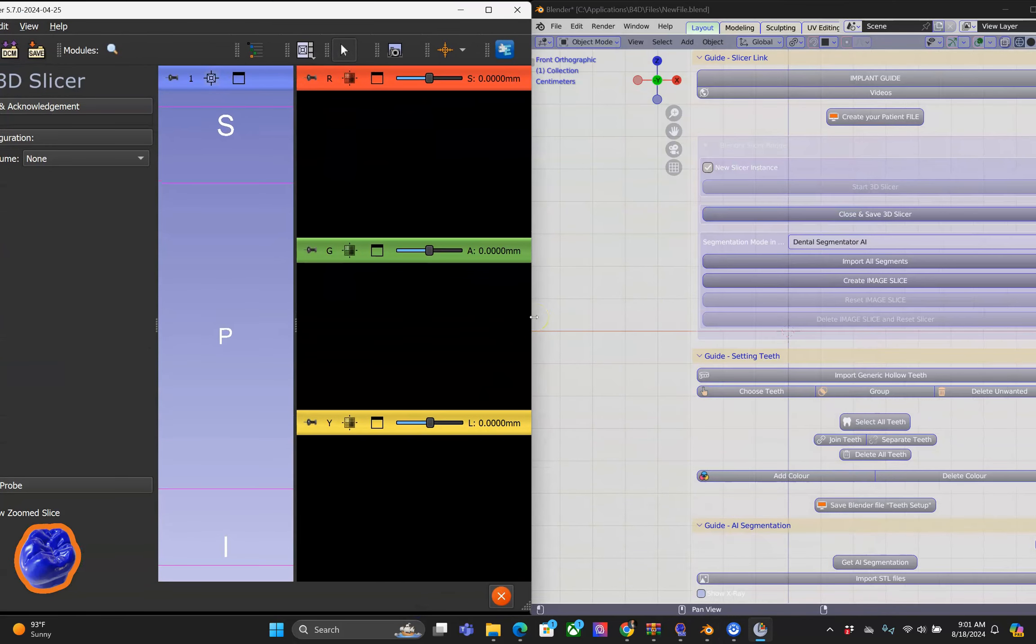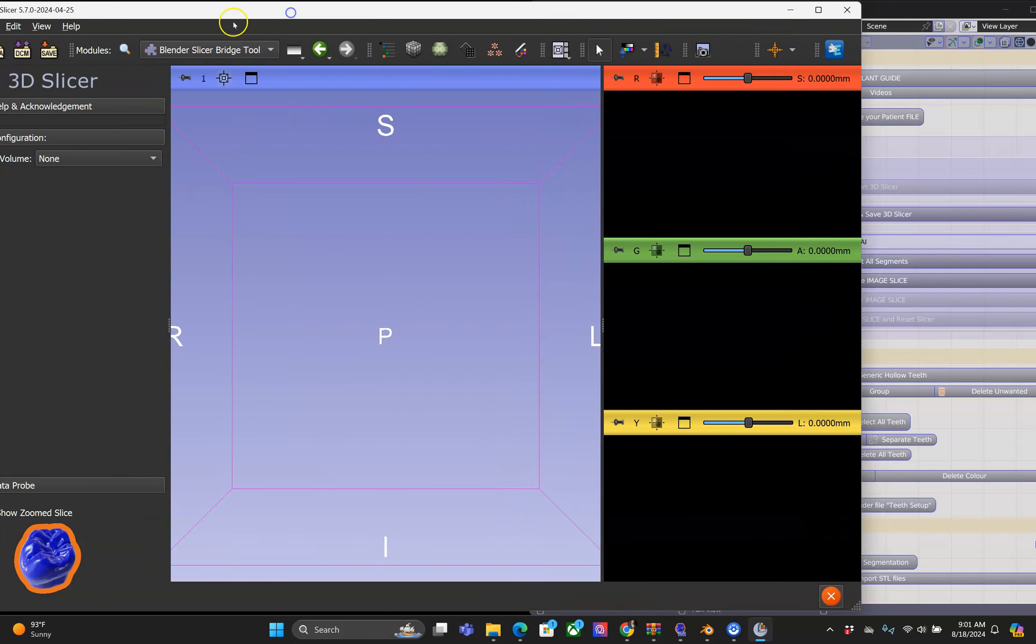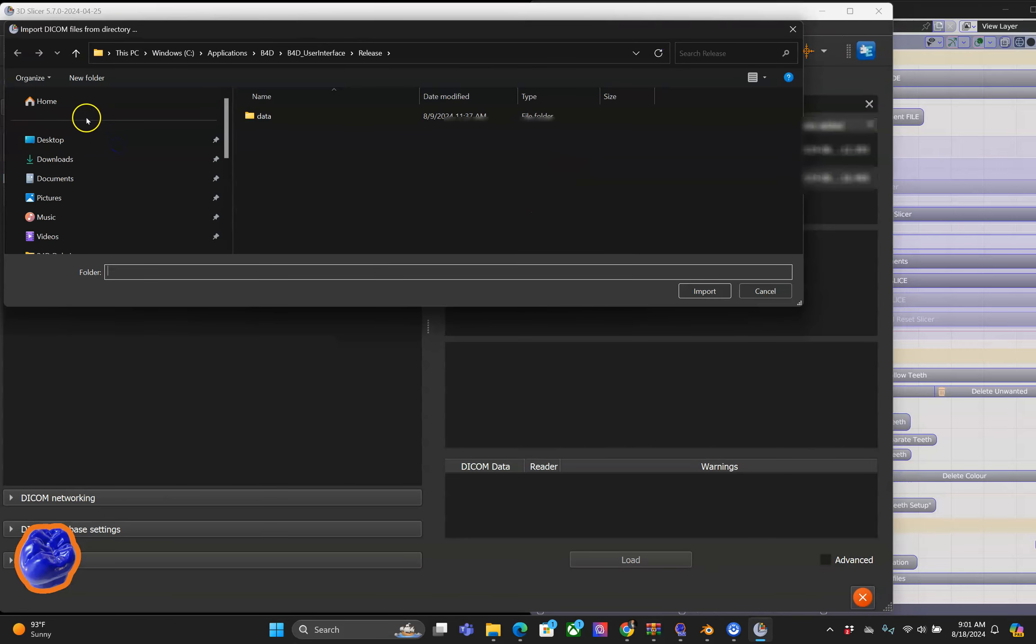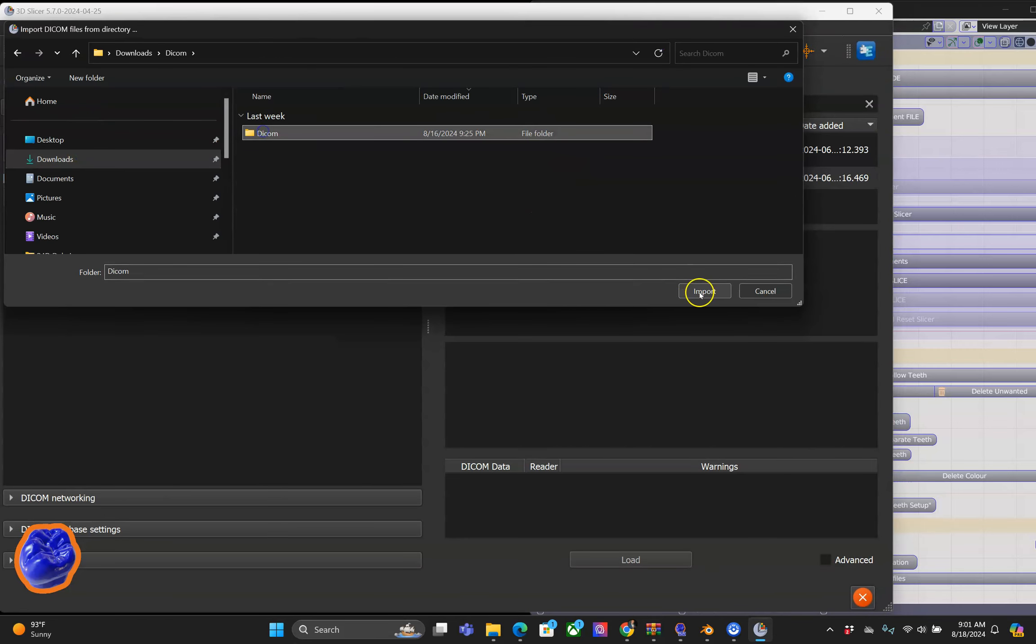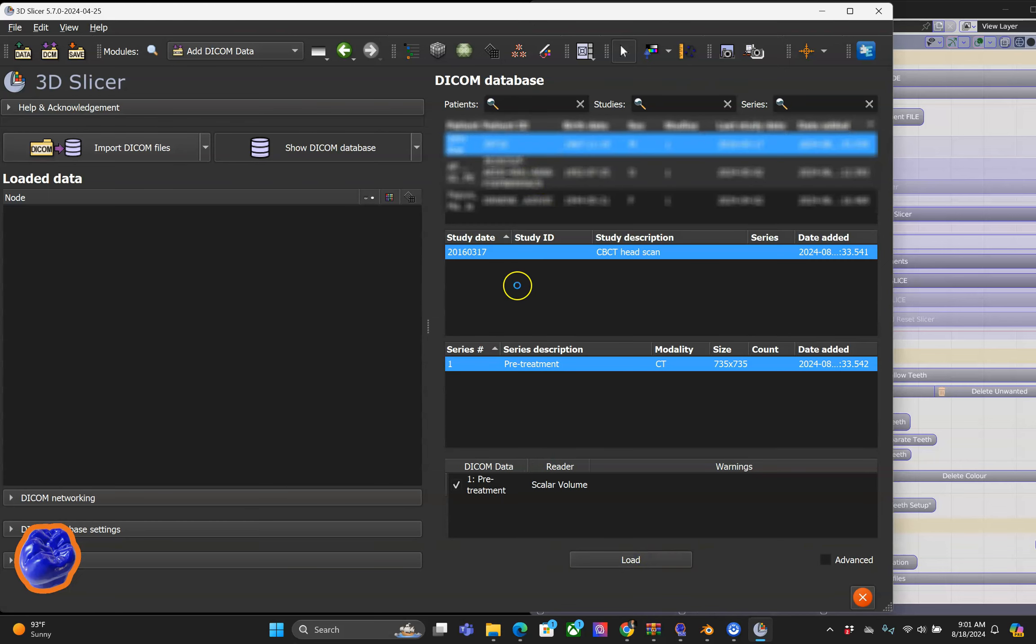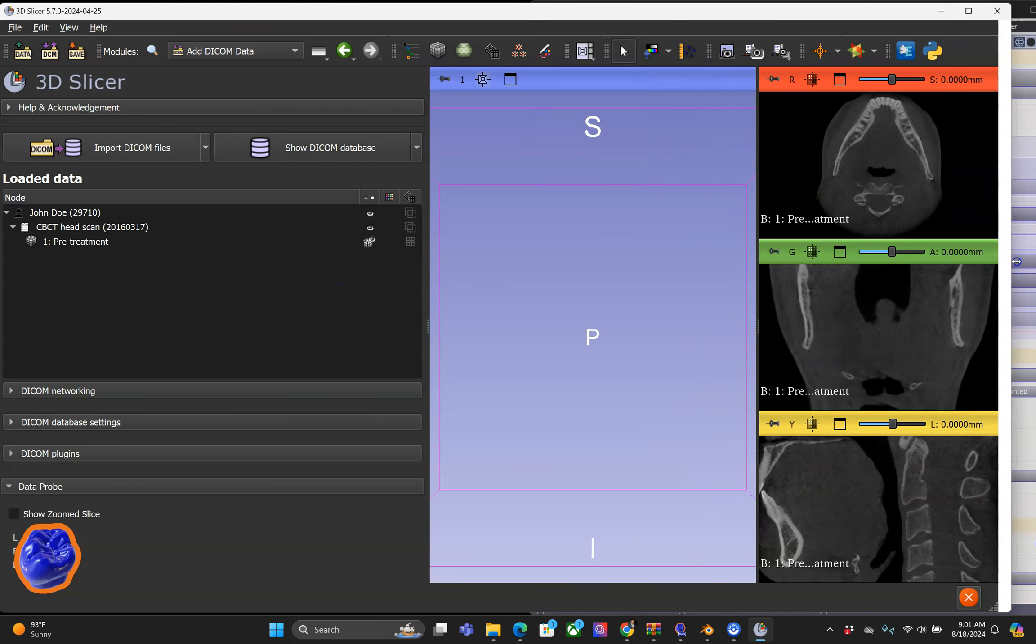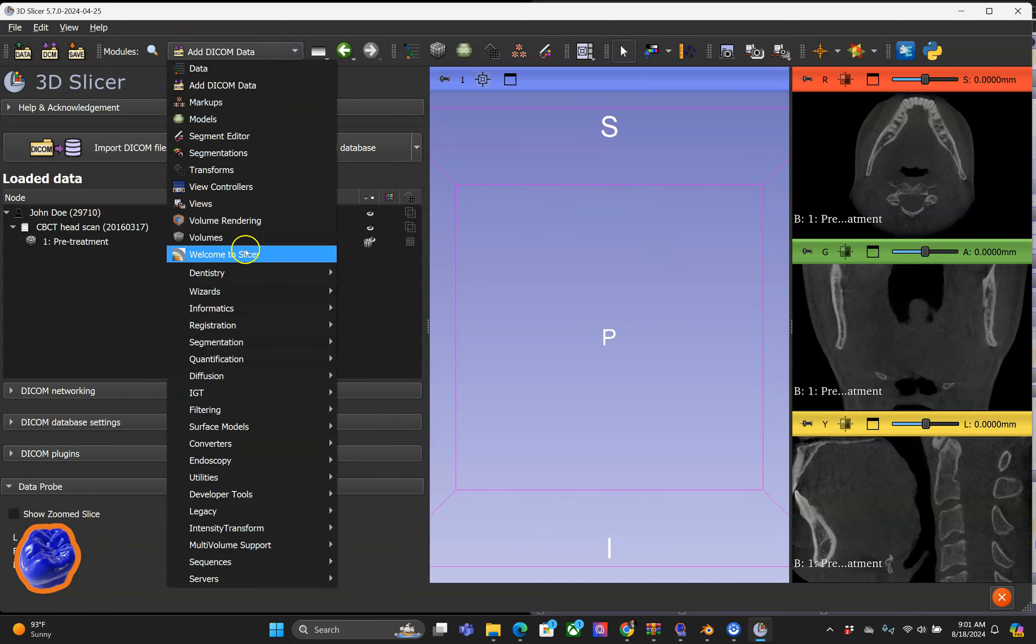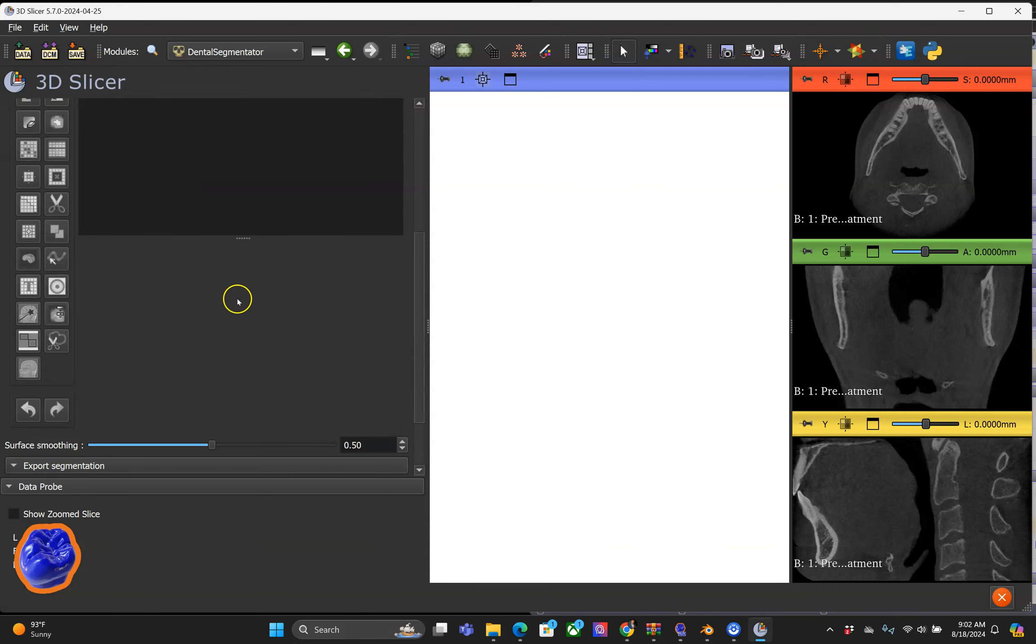It is better working with two display monitors if you can. Now here we're going to import a DICOM, and once it's loaded, we're going to use the AI Artificial Intelligence Segmentation program which was developed by Professor Gautier and his team in France.